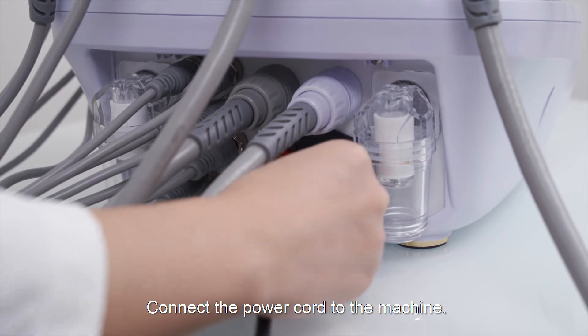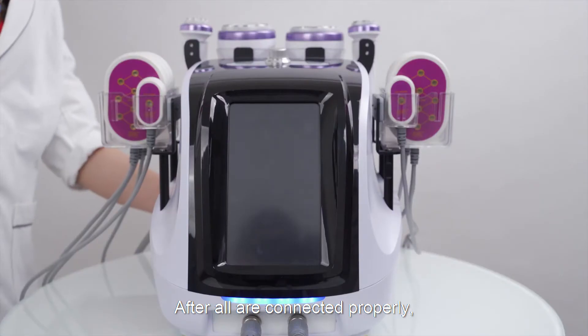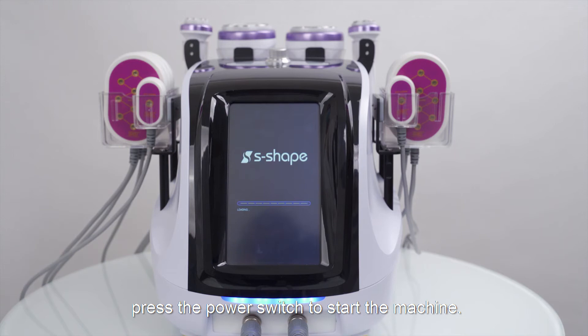Connect the power cord to the machine. After all are connected properly, press the power switch to start the machine.